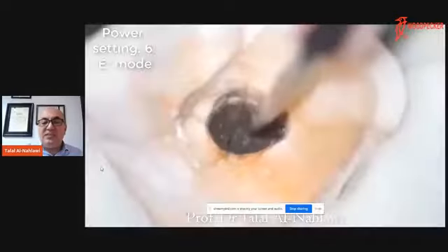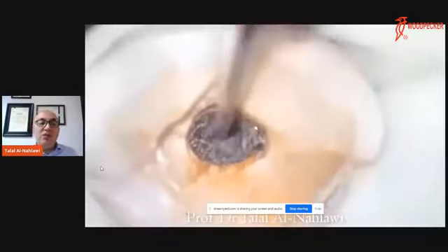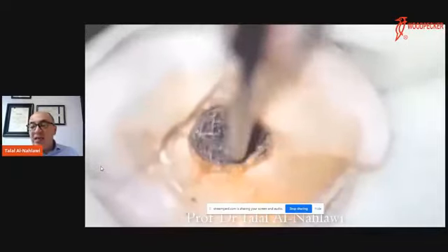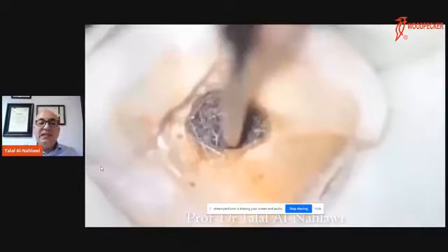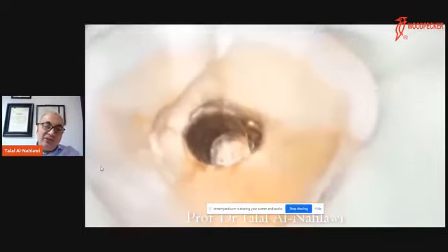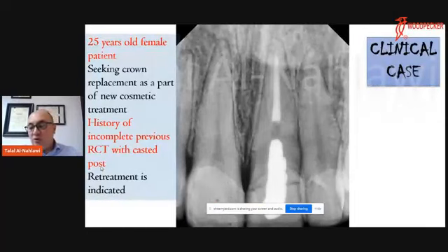And this is the remaining part, and you can see the glass fibers coming out from the fiber post, indicating that I am drilling in the middle of the fiber post till I can see and I can clean, and I can see that I'm going deeper now. Here I can shift to T1, for example, if I can see small traces, in order to remove the fiber posts entirely.